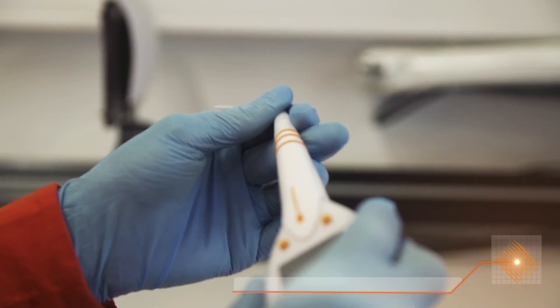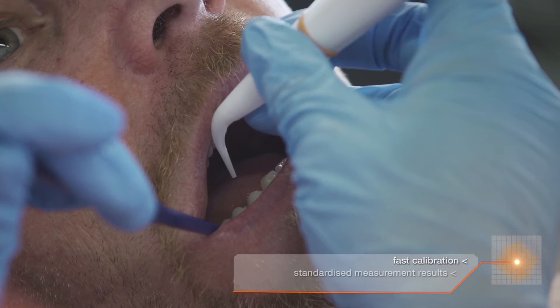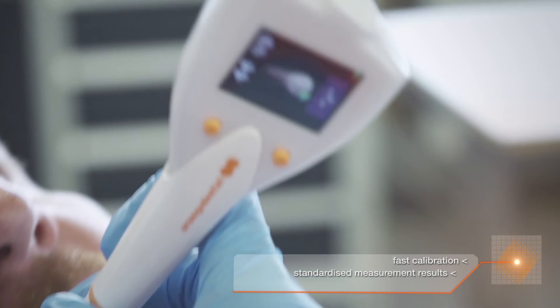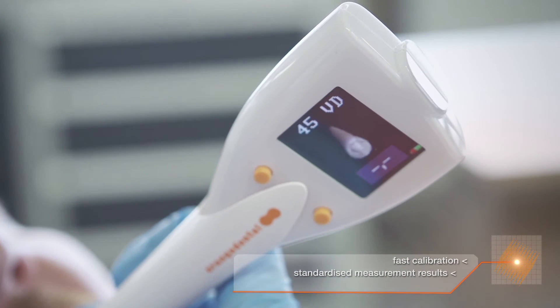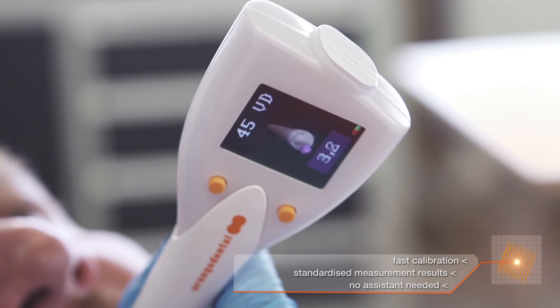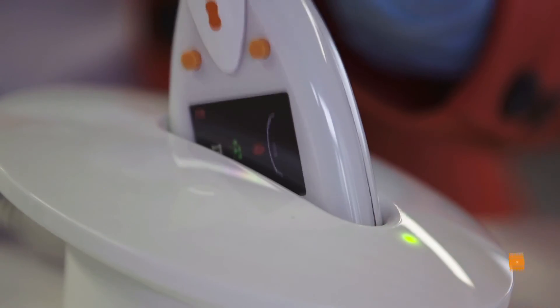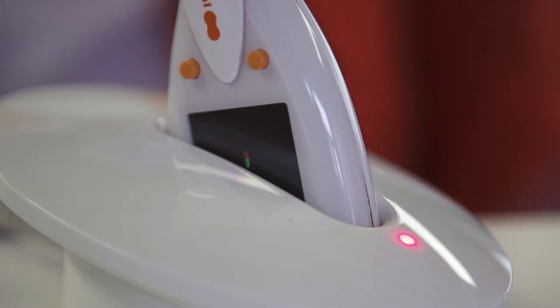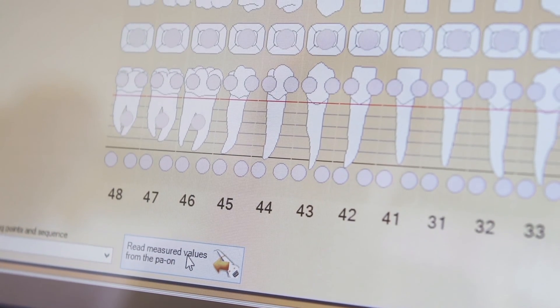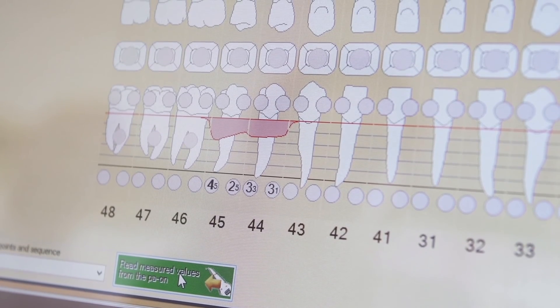Put on the hygienic measuring tip, calibrate it and you're ready to go. While you are recording, the probe gives you optic and acoustic feedback. You don't need an assistant to document the measuring results because the probe memorizes everything. After measuring, you just put it into the docking station. The data is automatically transmitted to the software — right away you see the results on your screen and can speak with your patient about it immediately.